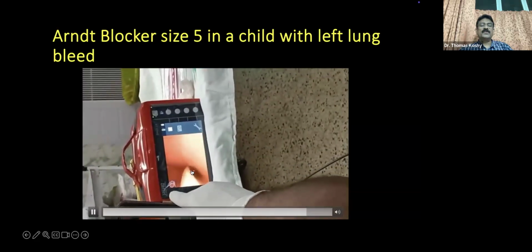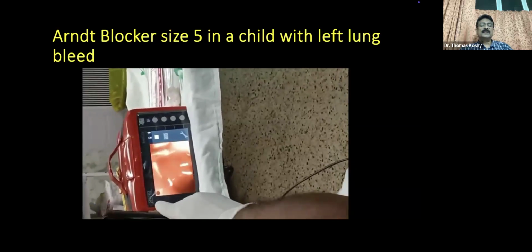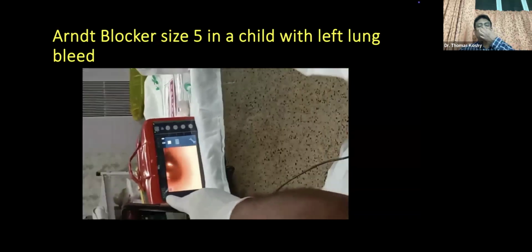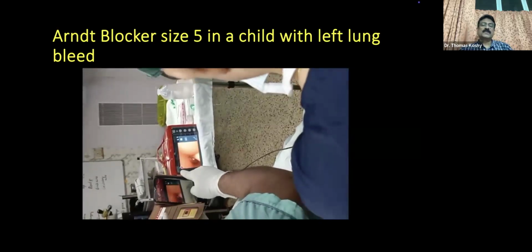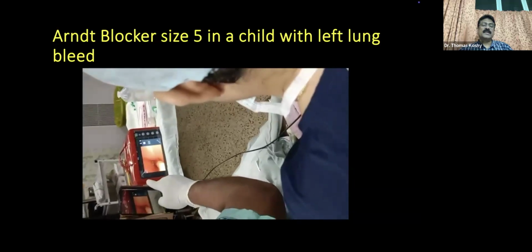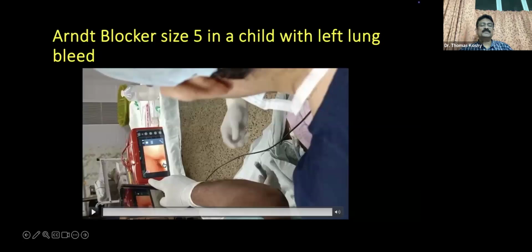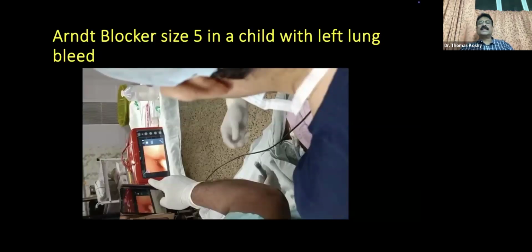Then you introduce and push that under vision. We push that blocker into the desired bronchus. Then we withdraw the FOB to visualize the balloon. It is all round. So this is how we put it. The procedure takes around 5 to 7 minutes.